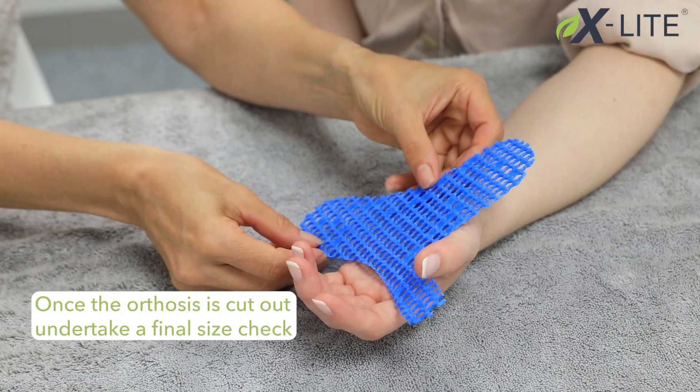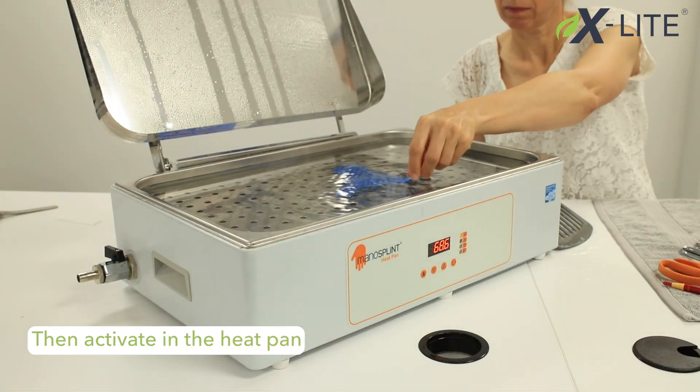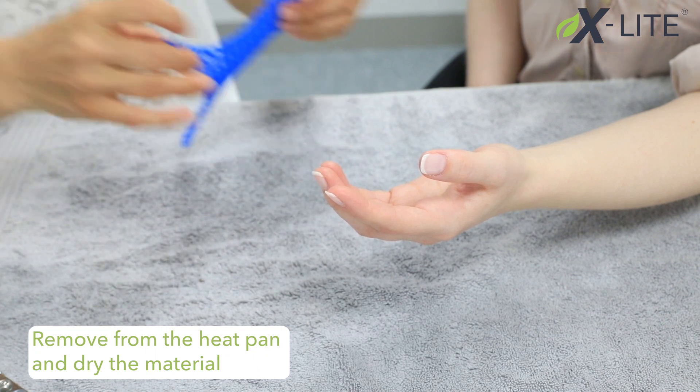Once the orthosis is cut out, undertake a final size check. Then activate in the heat pan and remove from the heat pan and dry the material.